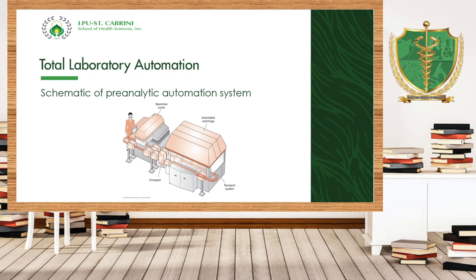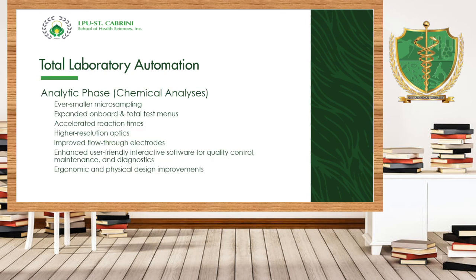You just have to load your tube, no? Kung siya ay serum, siya nang bahala mag-centrifuge din sa loob ng machine. This is an example of pre-analytical automated system. Yung mga malalaking machine, yun po yung pre-analytical automated na machine.